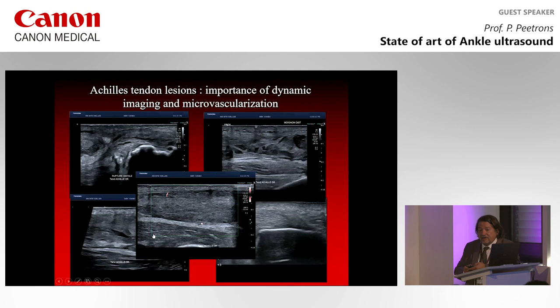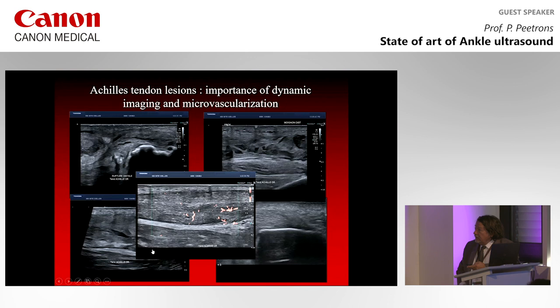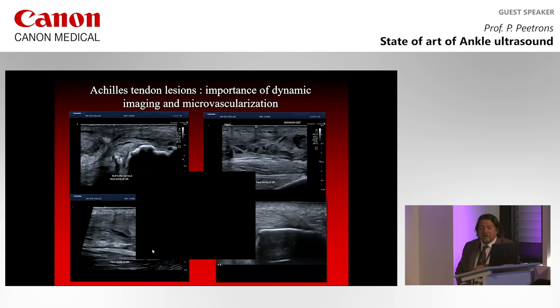And when you are looking at the Achilles tendon, normally you ask the patient to do a little bit of dorsal flexion of the foot to stretch the tendon. If you push the microvascular Doppler button and you don't remember that the foot is in dorsal flexion, you will see this. Nothing inside the tendon. No, nothing. And then suddenly you remember and you ask the patient to move to plantar flexion or to relax, and you see the microvascular imaging in the tendon.